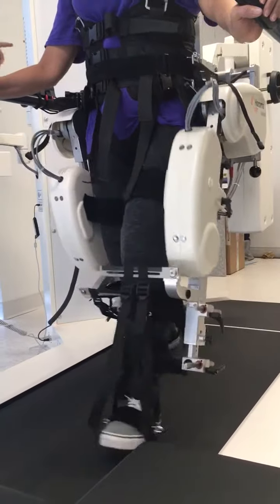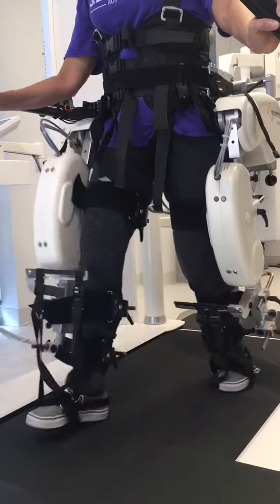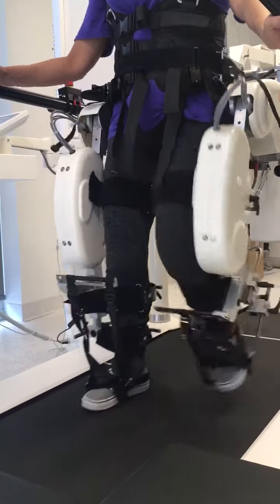You feel probably a little bit more pressure. Yeah, I feel like I'm bending it. Right, but you also have to walk actively — you have to extend. Open the device and extend. How the whole biomechanic changes, right?